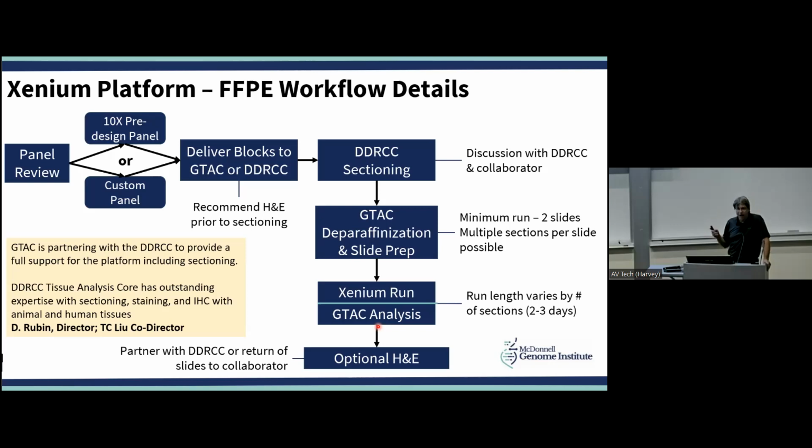And so if this is not something you feel comfortable doing in your laboratory, again, given the expense of these experiments, we strongly recommend partnering with the DDRCC to get your sections and make your slides. Very, very much recommended. Now, there are some labs that have a lot of sophistication with that and are very comfortable doing it themselves, because they do a lot of this stuff.